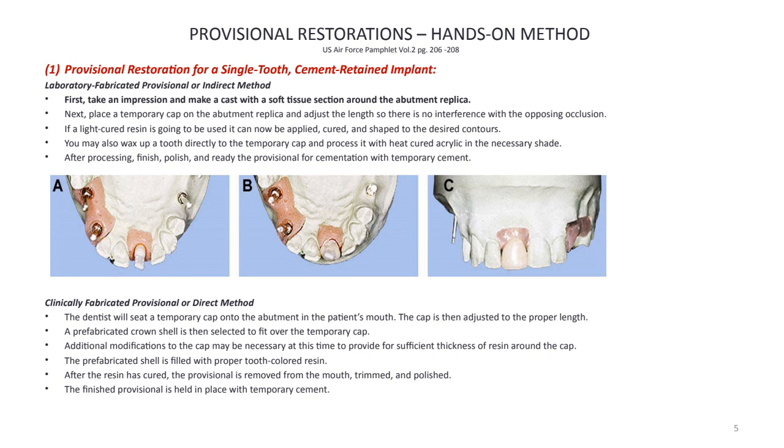So sometimes we may need to cut not only the length of the abutment, but maybe we need to reduce either the labial or the lingual aspect of the abutment to make the provisional restoration fit better over the abutment.